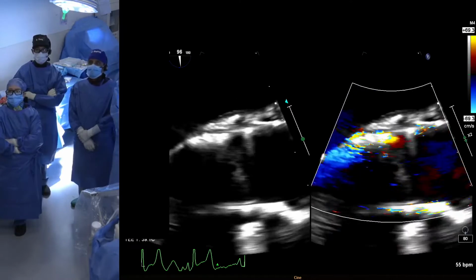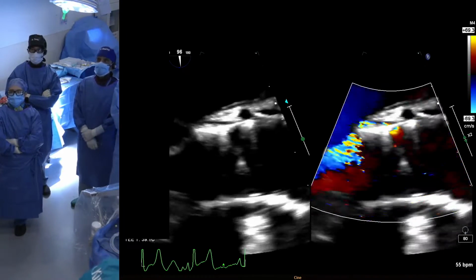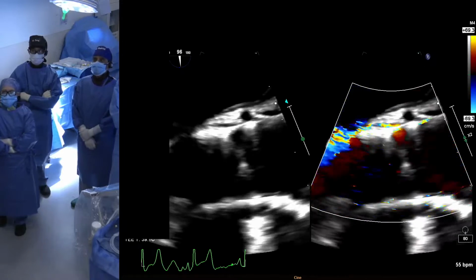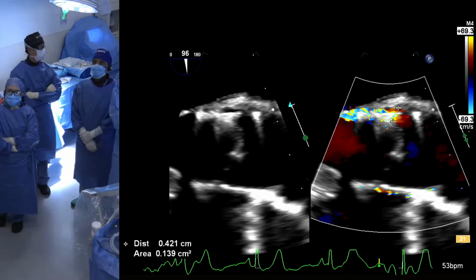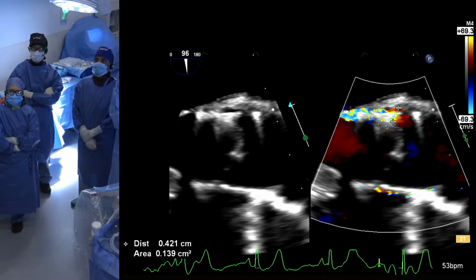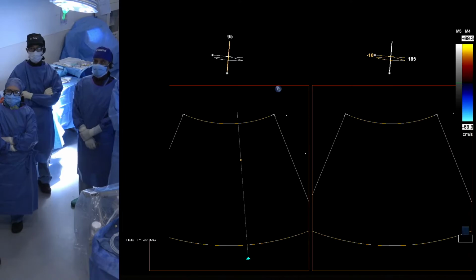And now here we are in the aortic valve. As you can see, the paravalvular leak comes from most likely an open cell and comes around the valve. It looks like a gap, right, Stan? Yeah, it looks like there's a gap. The valve is under-expanded, or as Gilbert said, the LVOT is big and the valve is small, so there's a space between the valve and the LVOT. The vena contracta is 4, which is in the moderate range.